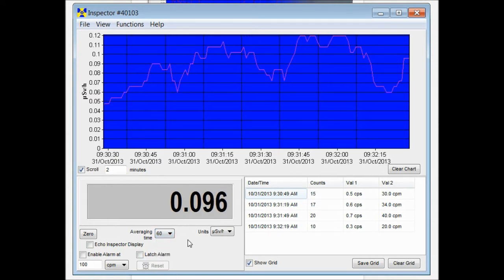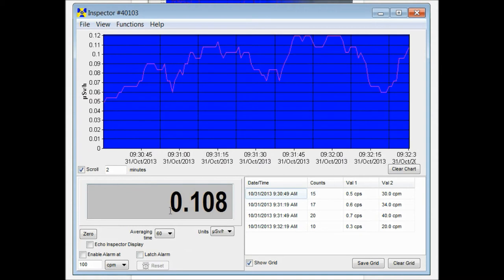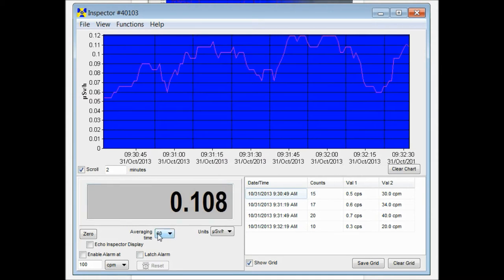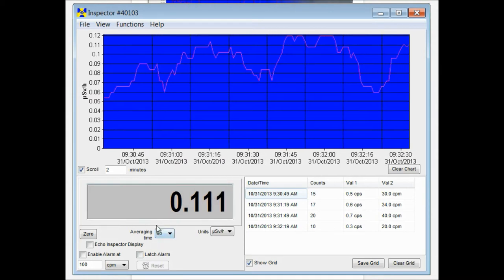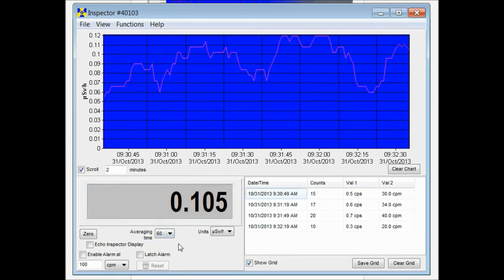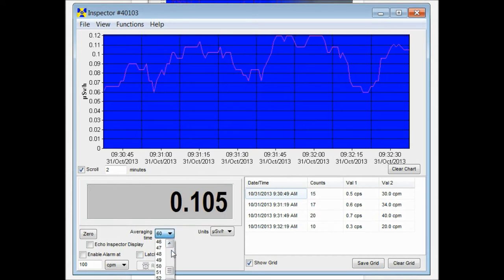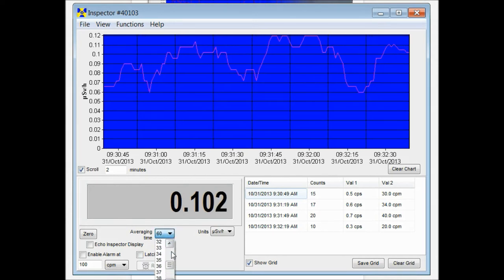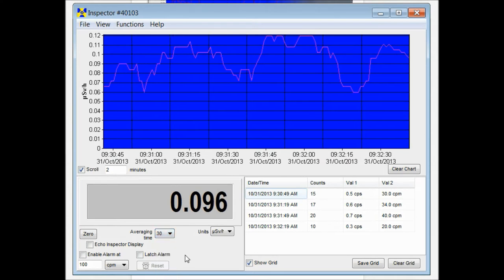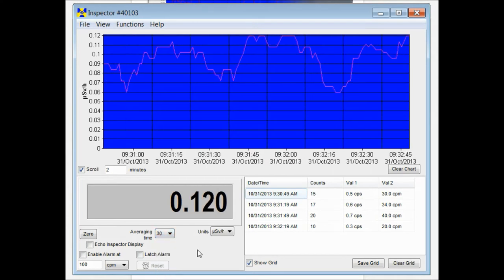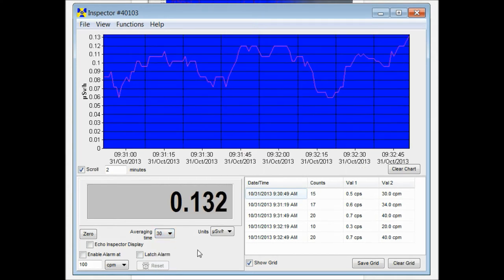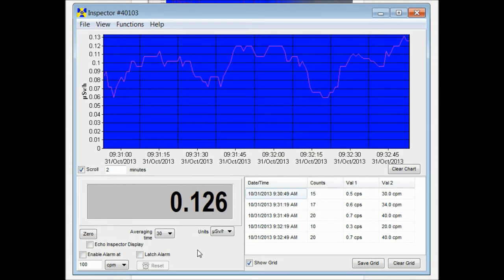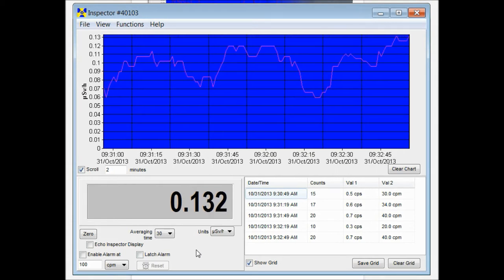That means that the readings that you're seeing are based on an average of the previous 60 seconds worth of collected data. Now by default on the unit, if you have auto averaging turned on, which is turned on by default, the readings that you're seeing on the display of your unit are based on an average of the previous 30 seconds worth of collected data.